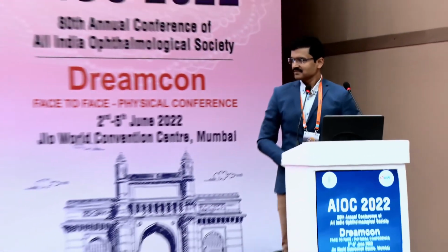So, an excellent technique. I have never used it, but I'll go and try this out, because I feel I have dropped more epinucleus into the vitreous cavity than nucleus. Nucleus is something you can hold, and cortical fibers you can hold, but the epinucleus is the one you are not able to grip and pull out.